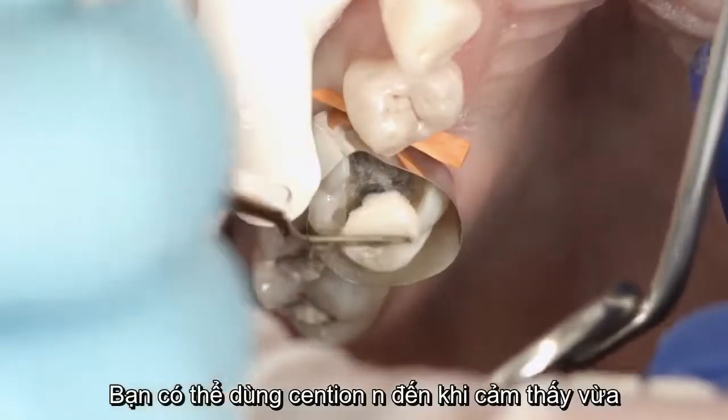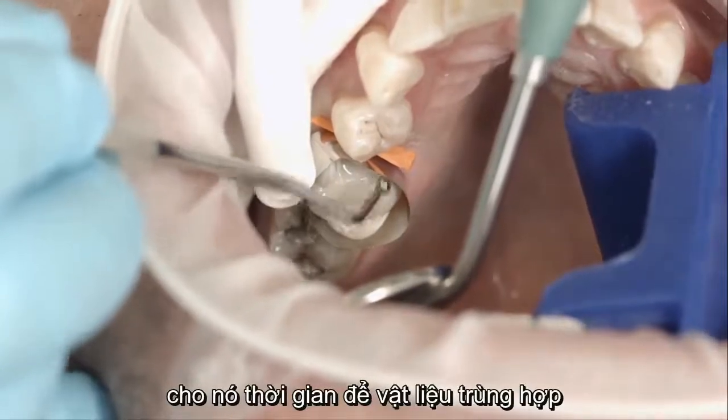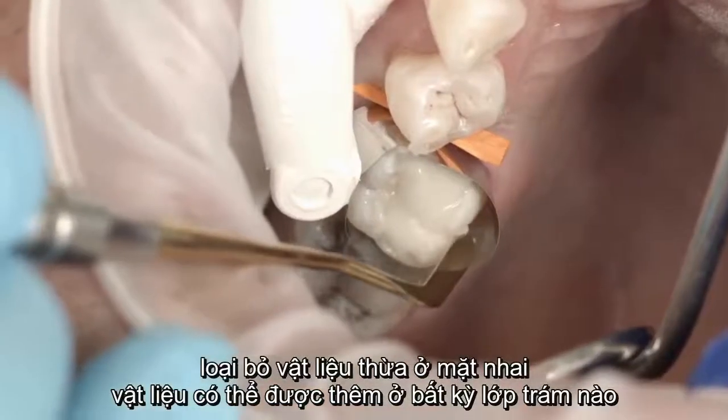You may apply as much Cention N as you see fit. Carefully pack the material into the cavity. Given its self-curing properties, the material can be applied in any layer thickness. Remove occlusal excess material.